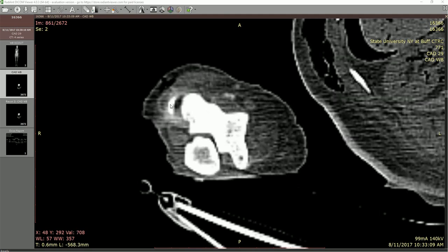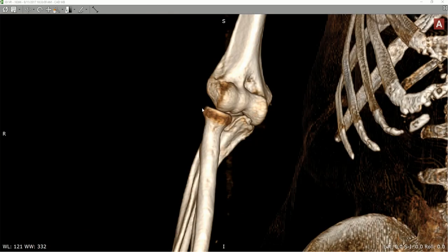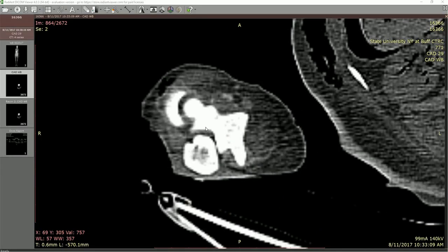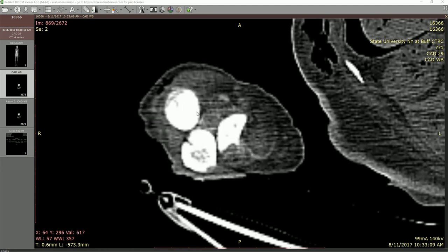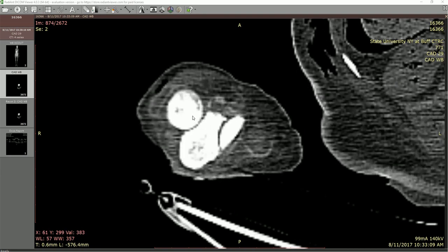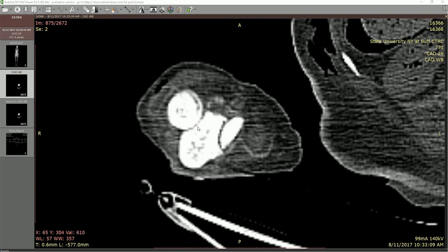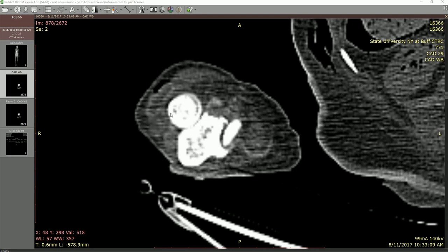Going a little further down, there's the lateral surface of the radius. The radius is not sitting completely flat — it's at an oblique line, so we're just starting to see the outside. As we continue to roll down, we see more of the radial head. That's the end of the capitulum — you can see the indentation in the middle of the radial head. And that would be the radial notch on the ulna. This would basically be the proximal radioulnar joint, where we get pronation and supination occurring.